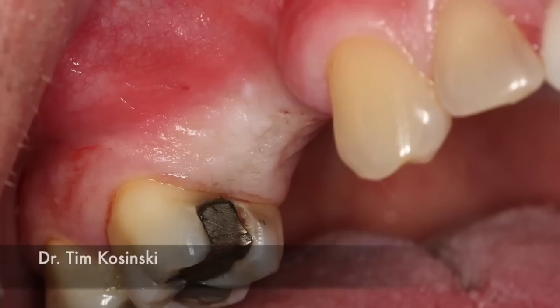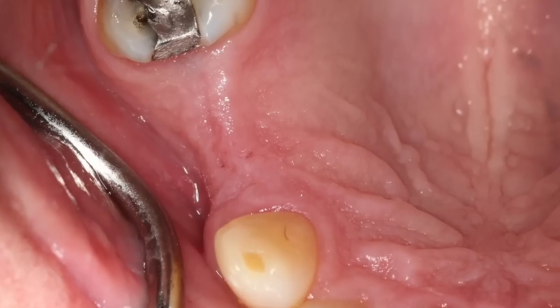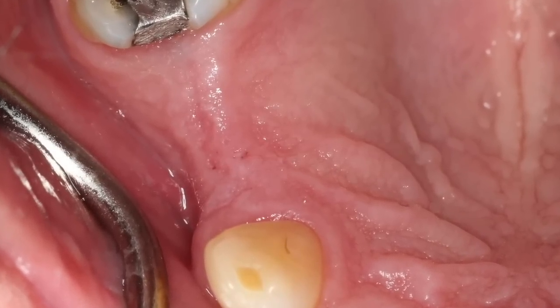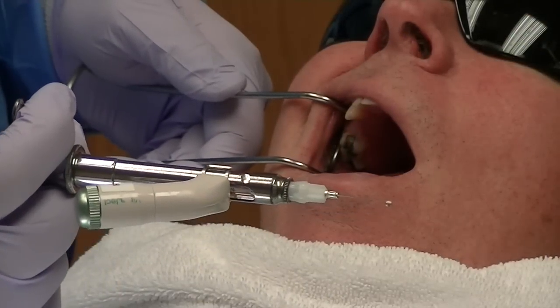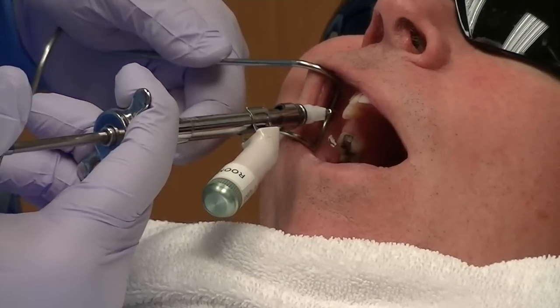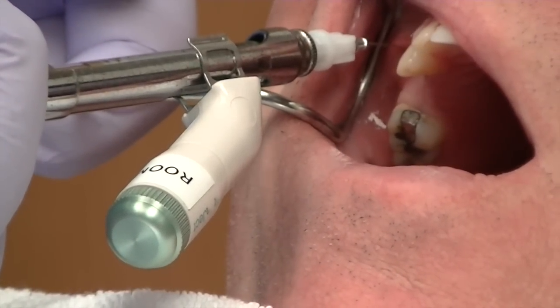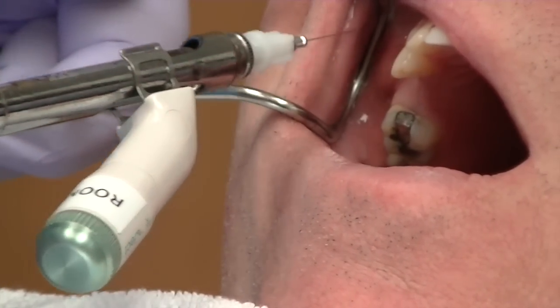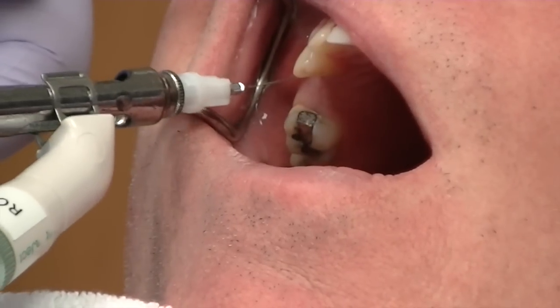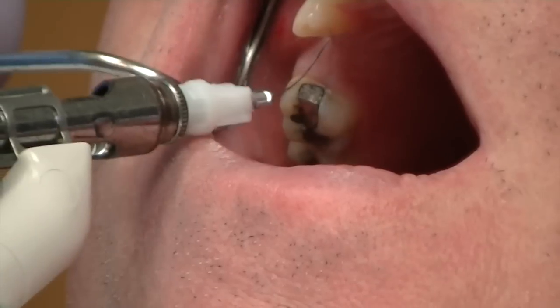We have an edentulous area in teeth number four and five. Now we go to the patient and what we're going to use is a really great tool called a Vibroject. It's a little instrument that attaches to your existing syringes and vibrates, which gives a motor sensation different than the pain receptor's sensation when we're injecting. I find this to be an excellent tool to get a positive response from your patient.